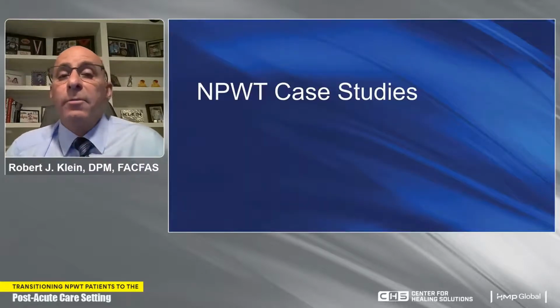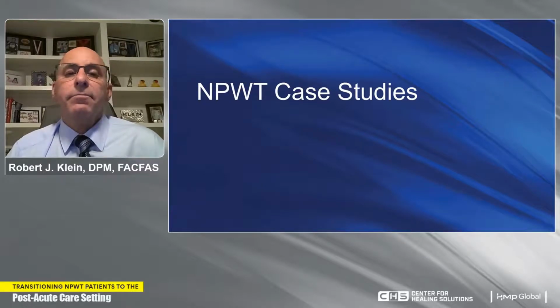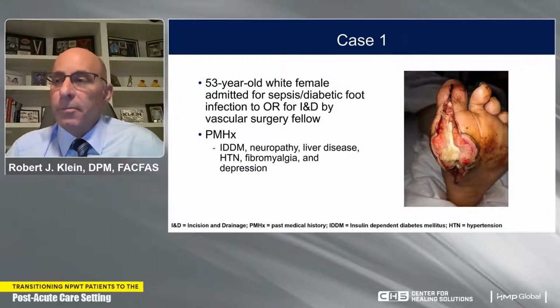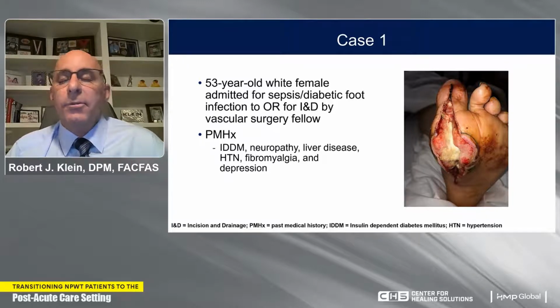I'd like to go over some of my negative pressure wound therapy case studies with you. I have 7 that I'm going to present. Our first case is a 53-year-old white female who was admitted through our residence clinic with a diabetic foot infection. She was taken to the OR the evening of her admission to the hospital for an I&D by the vascular surgery fellow. Her past medical history was significant for diabetes mellitus, diabetic peripheral neuropathy, liver disease, hypertension, fibromyalgia, and depression.